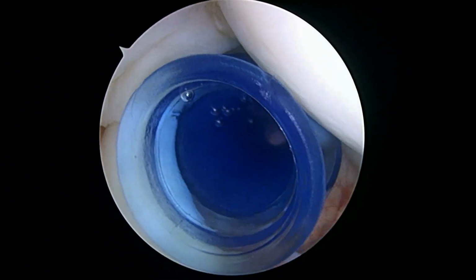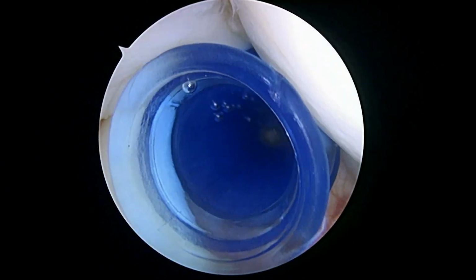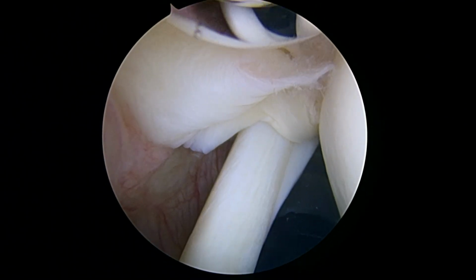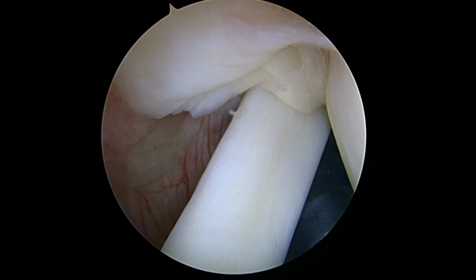Remember, you're laying on your side, so the top of the screen is really heading up towards the top of your shoulder, and that's where the rotator cuff tear is. Here you can see the rotator cuff tear. I'm going to put in a shaver.